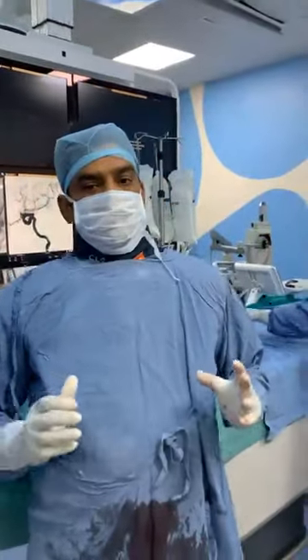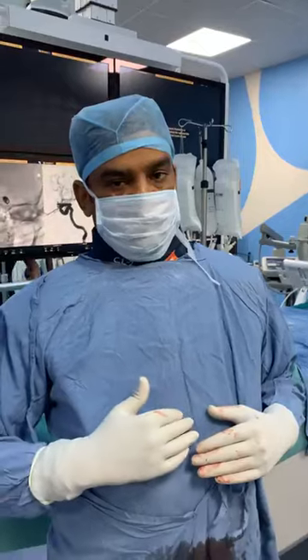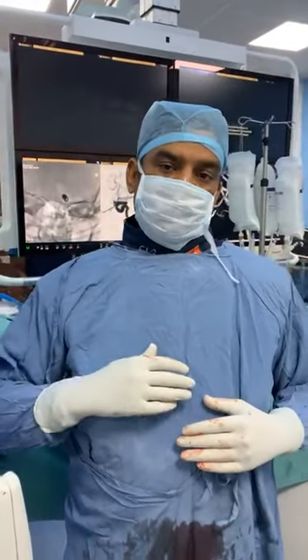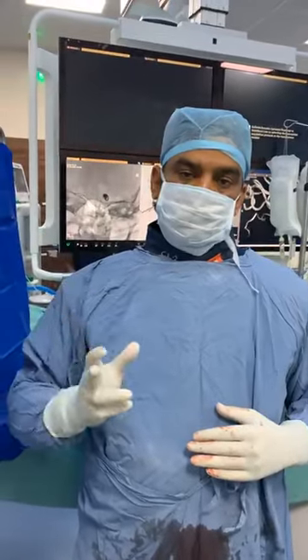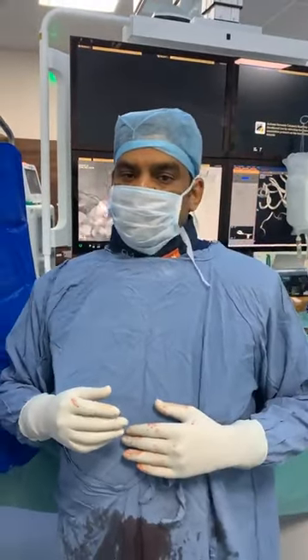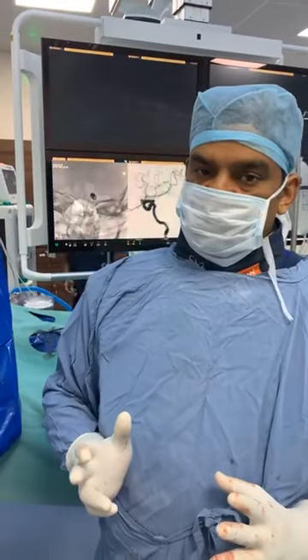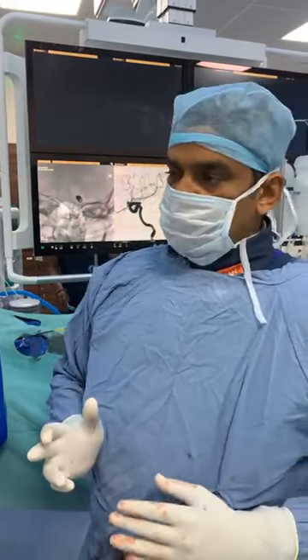So what we did is we crossed the aneurysm with a 6-French Neuromax, and then the catheter, we crossed the aneurysm, and there was a loop in the microcatheter, which we straightened. Now we will take a flow diverter inside the microcatheter and try to deploy it and see how it behaves.